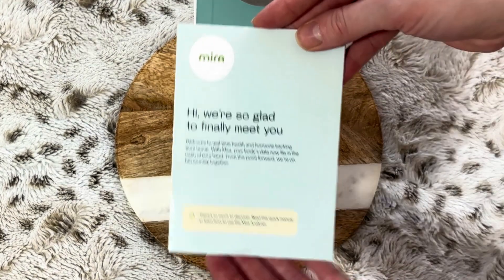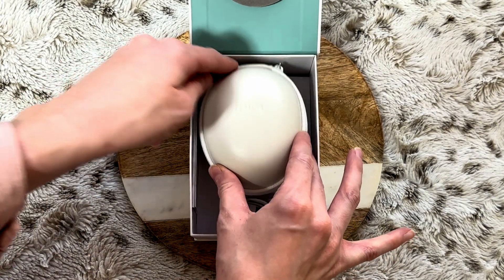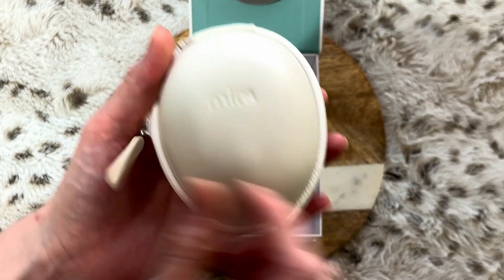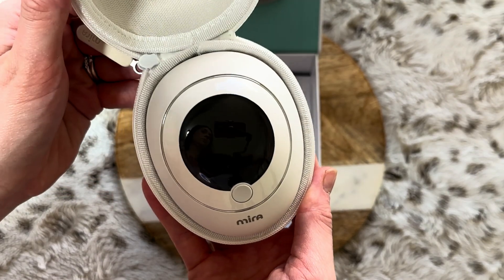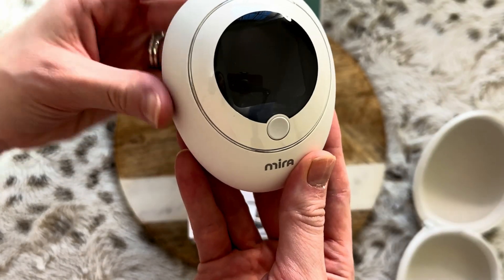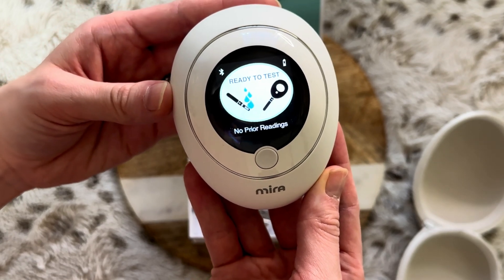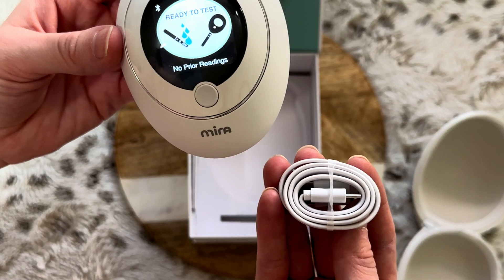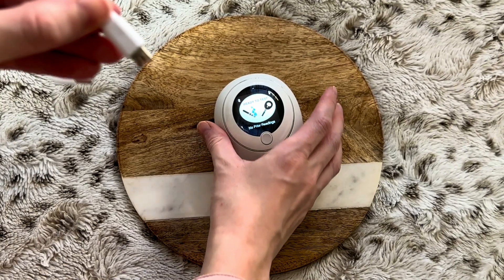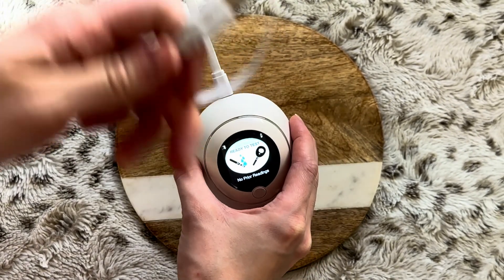When you first open your Mira box, you're going to have your quick manual guide, and then your Mira device inside a little case — it's very nice that it comes secured that way. When you get your device, the battery will not be fully charged, so make sure that as soon as you get it, you plug your Mira in to charge. It comes with a charger, so also download the Mira app right away so that whenever you're ready to start testing, you already have the app downloaded and the device charged.